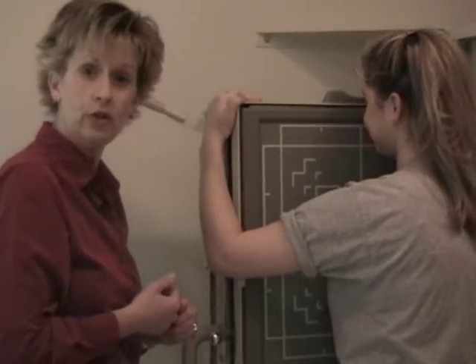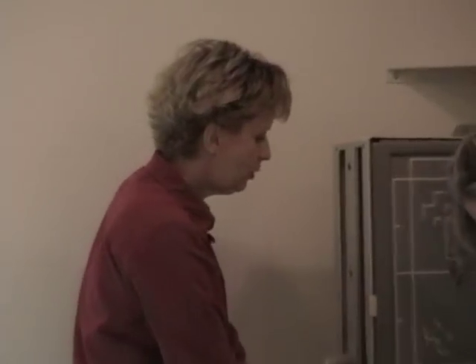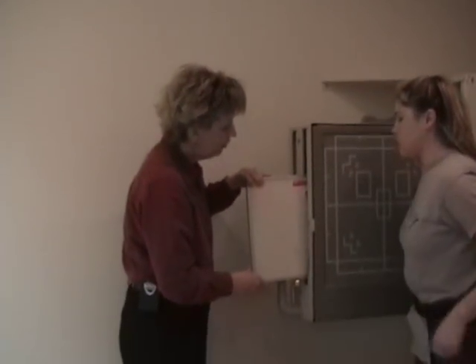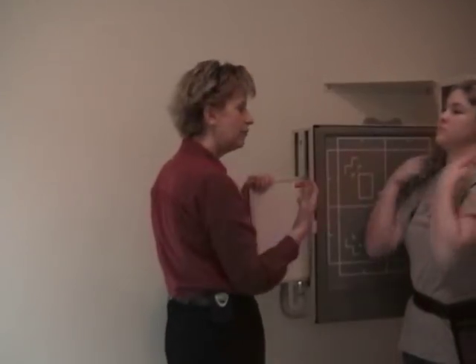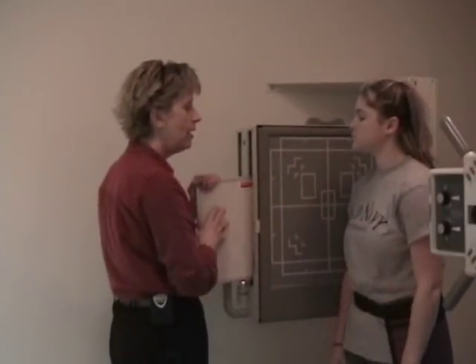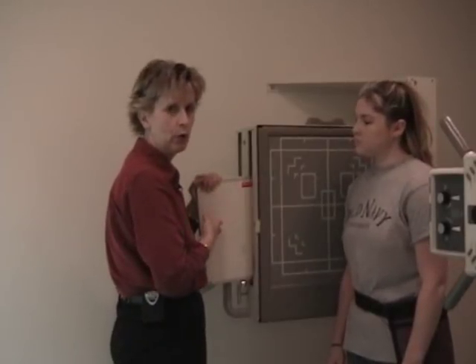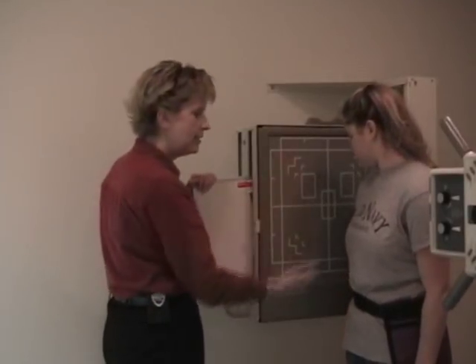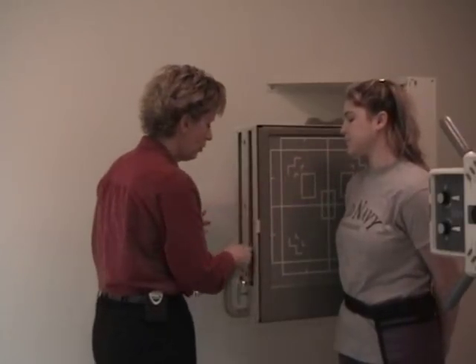Okay. We're going to change films and position for a lateral. Same 10 by 12. ID to the top. I'm actually going to do a right lateral in this setup because my patient can face me and I can see the centering. If you were in a room with different orientation, a left lateral would be more than adequate. But I like to see the sternum and I like to work from the front side of the patient, so I'm electing to do a right lateral.